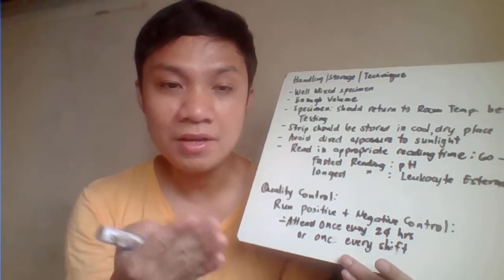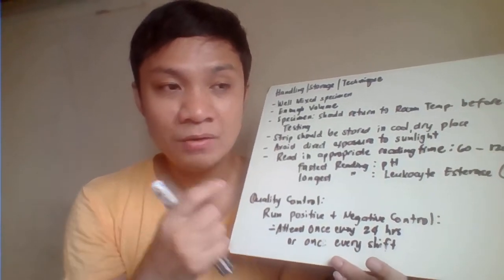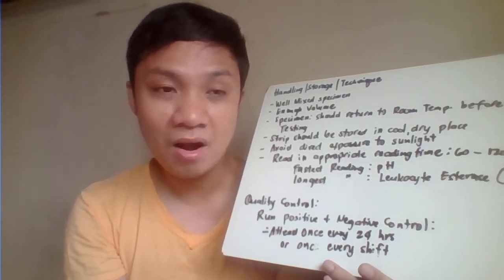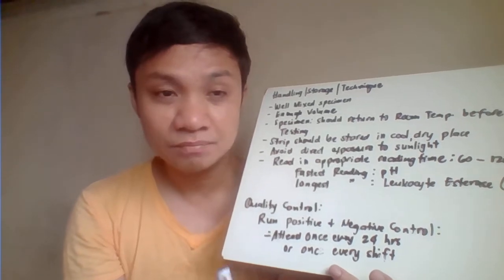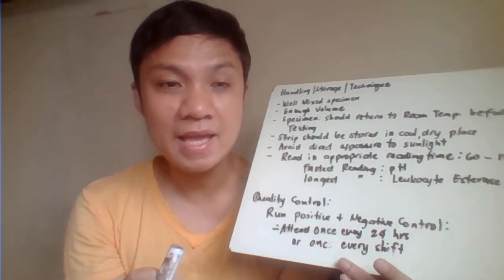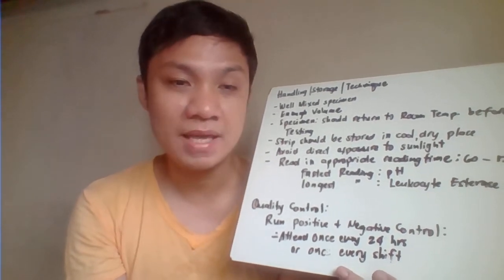Or if you can afford it, you can perform it once in every shift. Every shift, meaning every shift duty hours, so 8 hours, you can perform that. But once a day is okay. Once a day is acceptable.